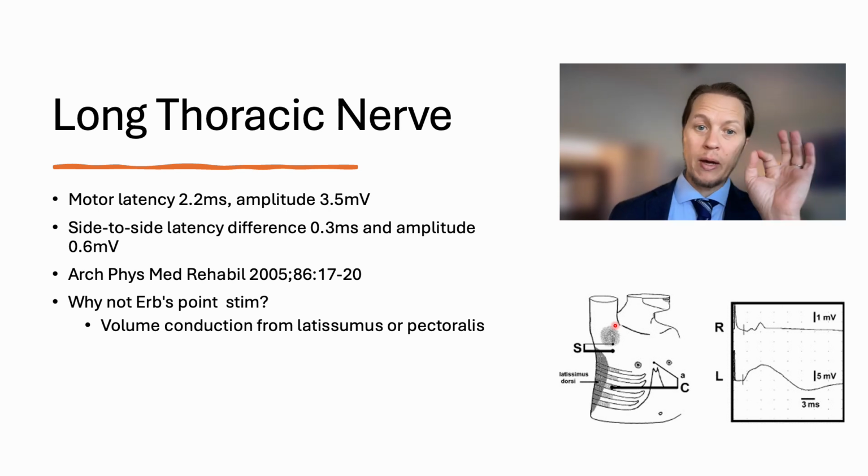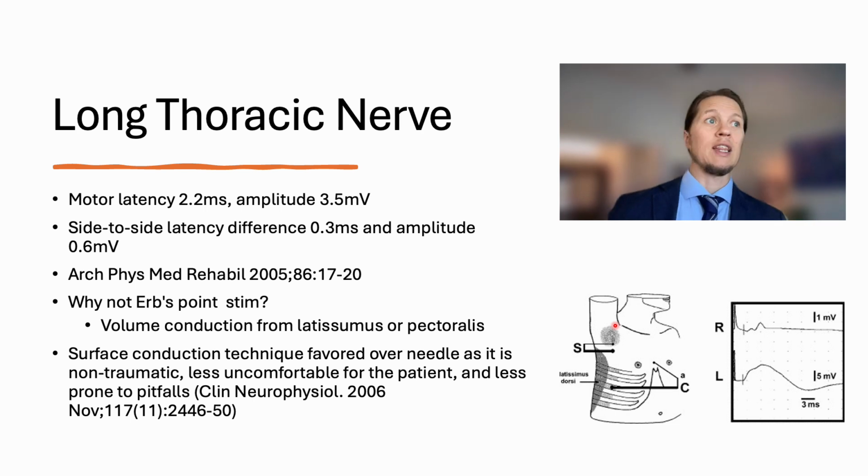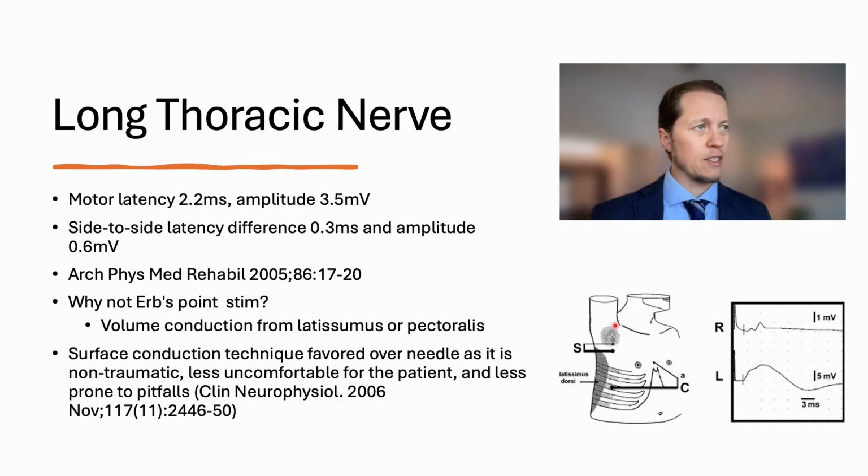Another idea is, what about needle stim, right? We still like surface over needle because, well, you're risking pneumothorax, number one. It's certainly less uncomfortable for the patient, and you're not going to get as many problems. So we still do nerve conduction with surface electrodes. I would not use the bar. I would use the strip electrode, and you get some really nice waveforms.